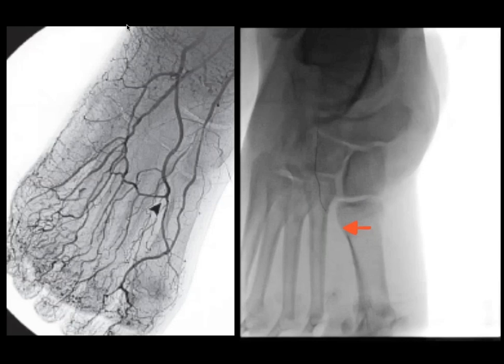So let me show you now, for those of you who have never seen what navigating the pedoplantar loop looks like. Again, I'm showing you that angiogram, which is normal on the far left, and then now I want you to watch the angiogram to the right. There's our pedoplantar loop. I want you to notice I have a CTO catheter, and notice that bending at the red arrow, that prolapse that's occurring. That prolapse is the clue of where that first bend is.